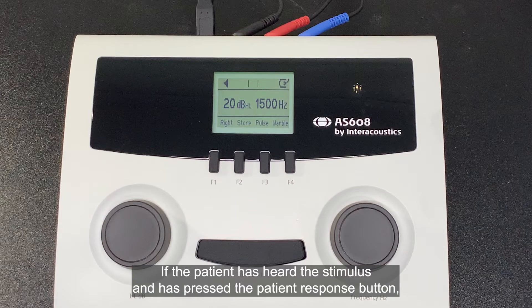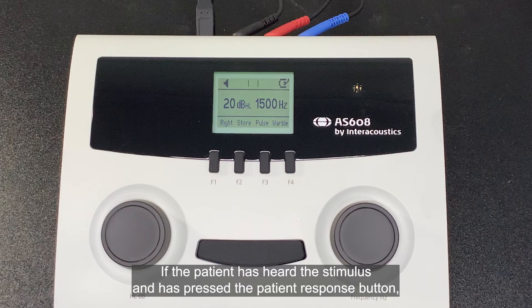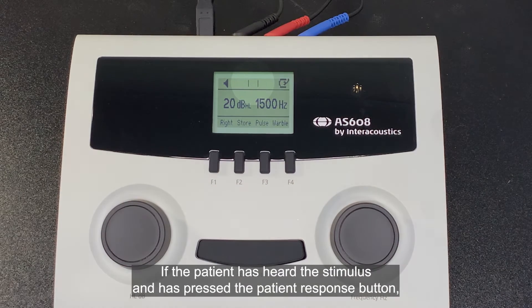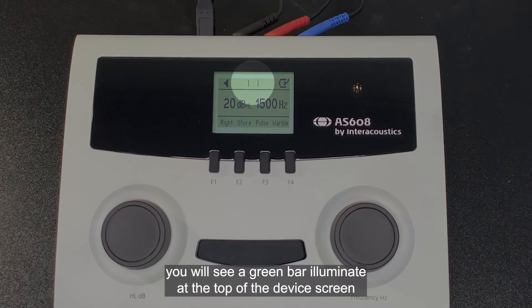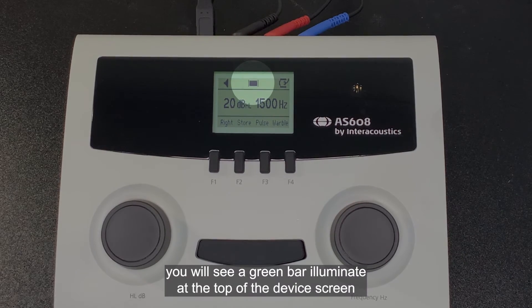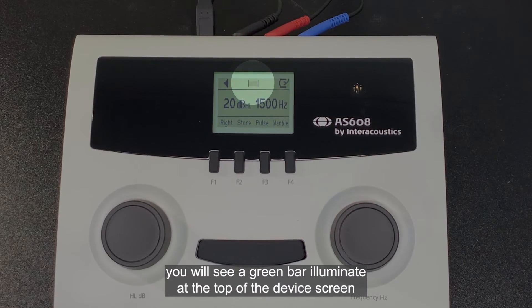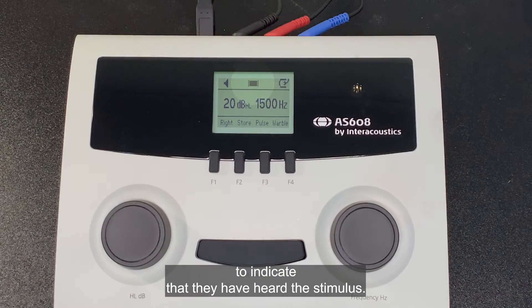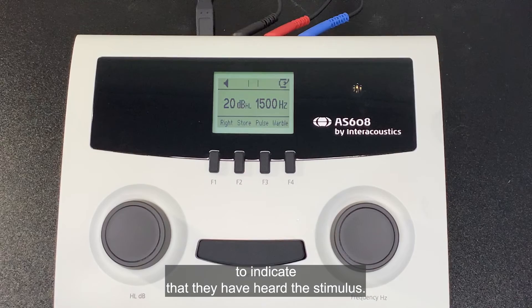If the patient has heard the stimulus and has pressed the patient response button, you will see a green bar illuminate at the top of the device screen to indicate that they have heard the stimulus.